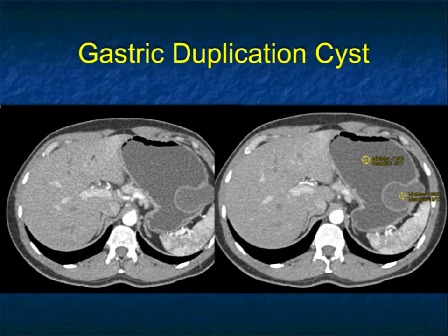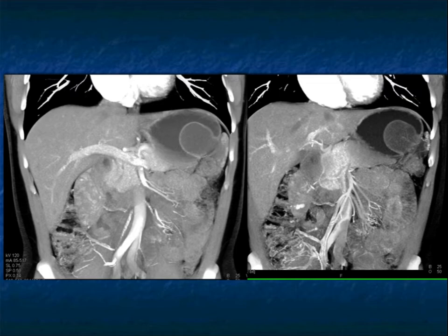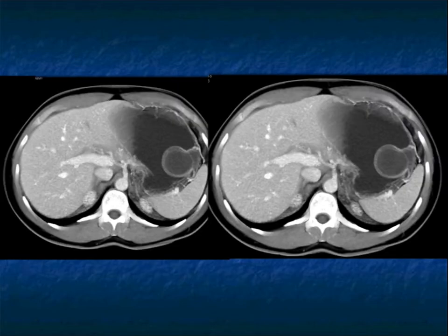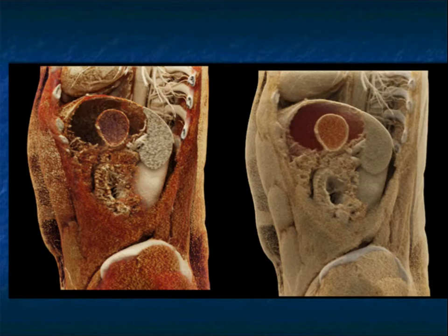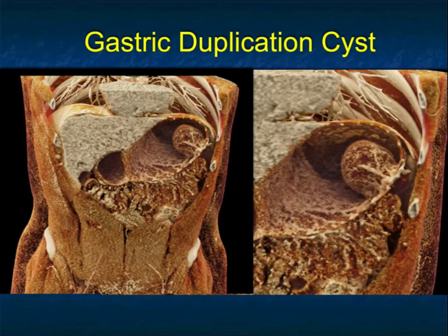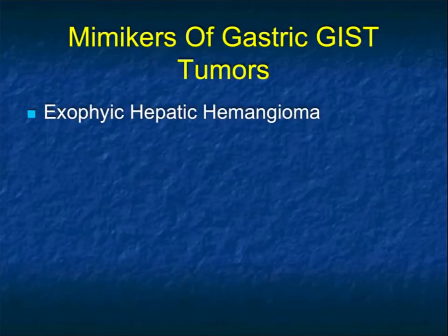Now other mimickers. Here's a lesion which is both intraluminal and extraluminal, though mainly intraluminal, and it's water density. Remember, even necrotic GIST tumors can be necrotic, but this is water density and homogeneous — this is not a GIST tumor. This is a duplication cyst. Duplication cysts are uncommon. It has some intraluminal and extraluminal components giving that dumbbell appearance that might make you think of a GIST tumor. But the water density, homogeneous appearance, and slight wall enhancement make this a beautiful example of a gastric duplication cyst.